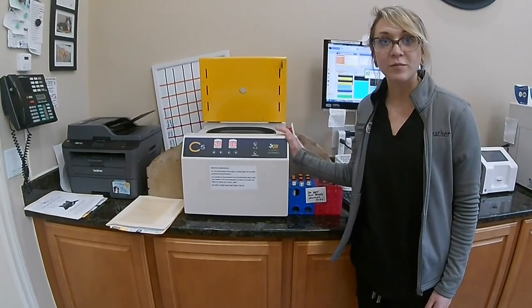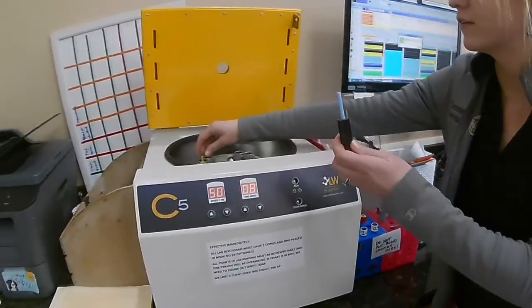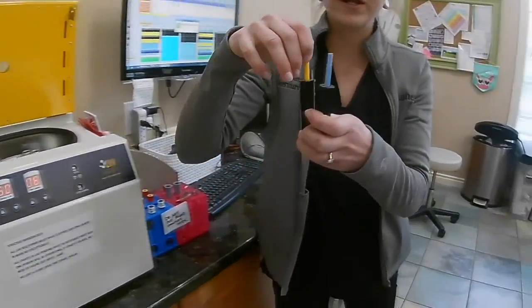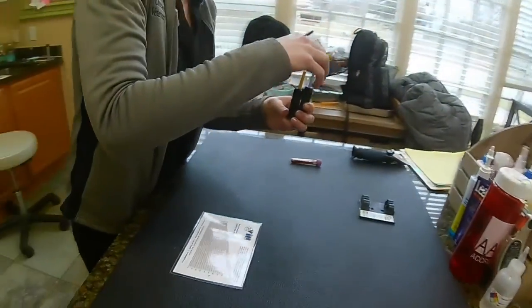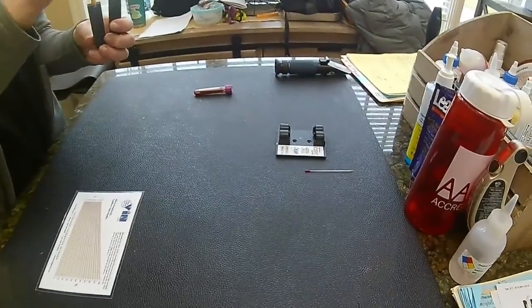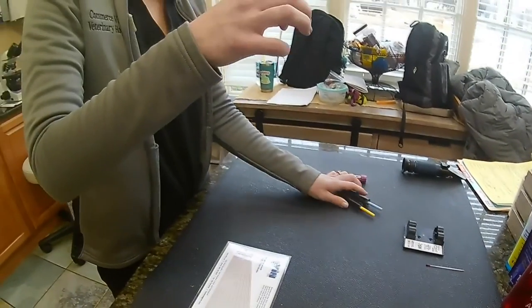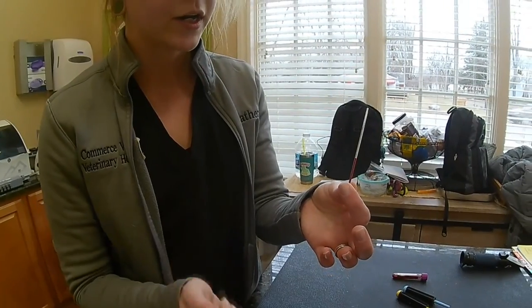All right, so our samples have finished spinning, so we're going to take them out, and we're going to look over on our little grid here. That is going to give us our percentage. So let's take a look at what we got. So that one, not so good. This one, on the other hand, worked out pretty well. Okay, so this is what we're gearing for.